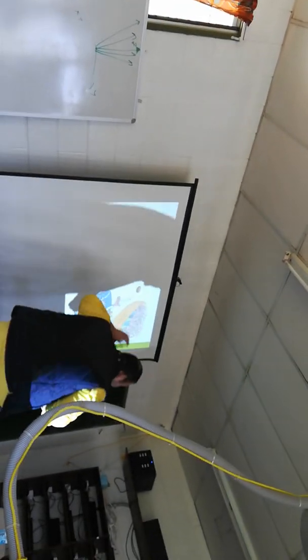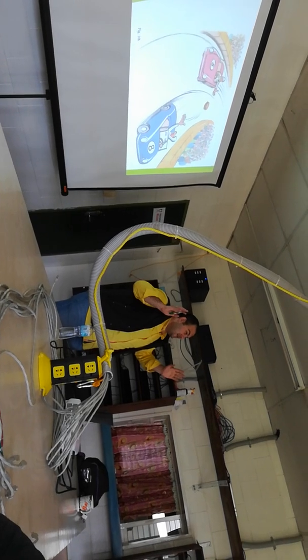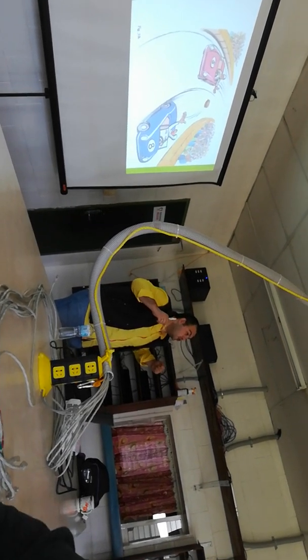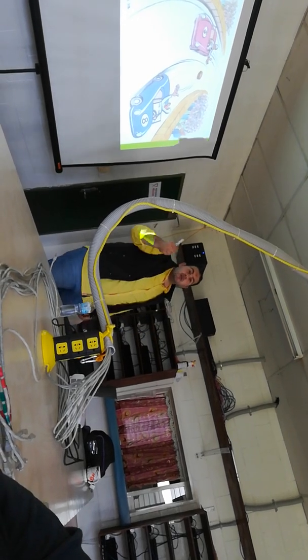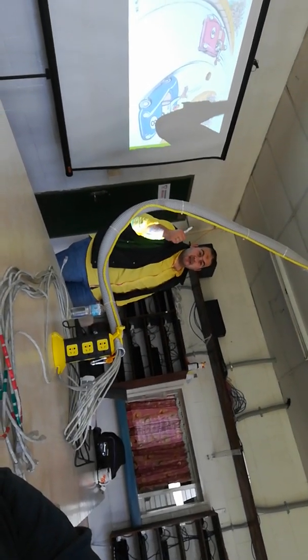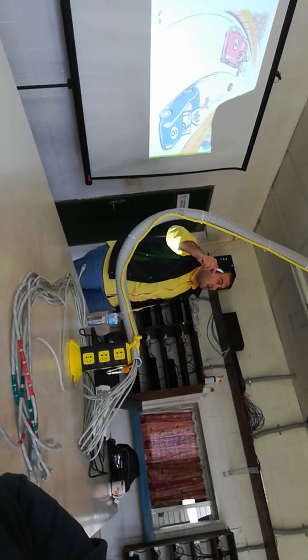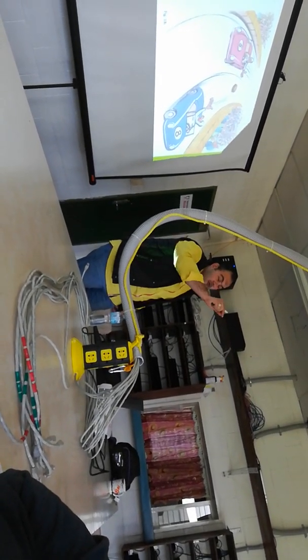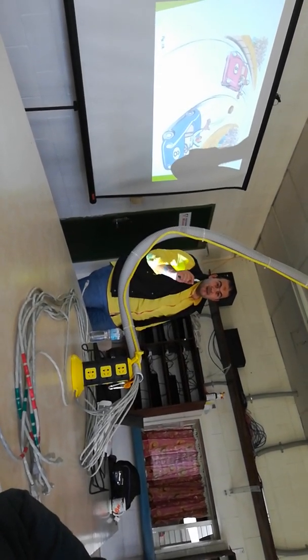So now, talking about transferring radio waves, okay? To transmit radio waves, we need resonance. We need to send radio waves with the same energy, the same frequency as the precession frequency of protons inside our bodies. You understand?